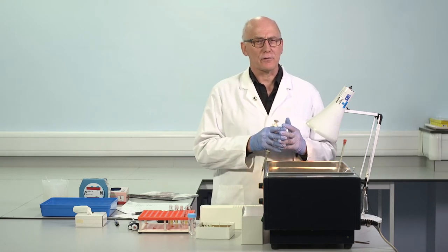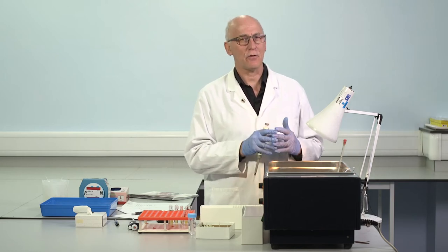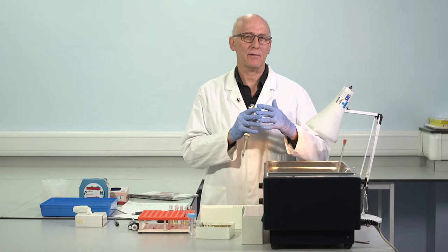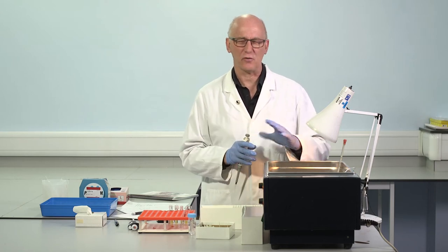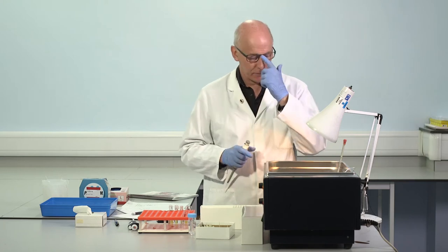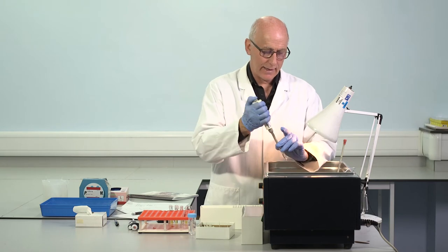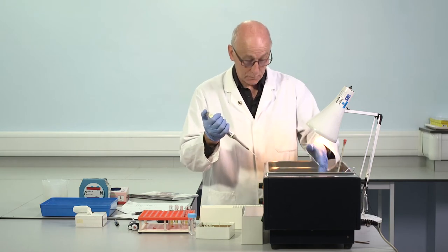And so we're not using the control to give us the relationship between the patient result and the control result, that's not going to tell us whether the patient is normal or abnormal. It gives some clue, but no more. For this, we absolutely need a careful reference range, which we'll talk about now. But first, let's start the activation on patient number 2.